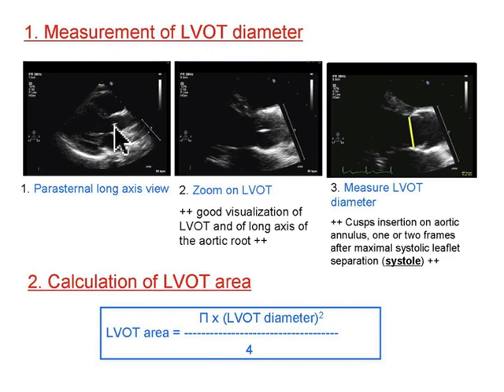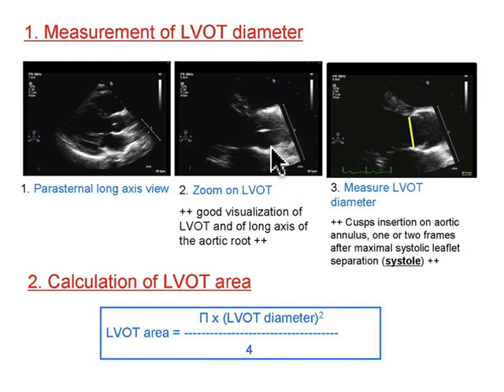Right now I can tell that this aortic valve, when the leaflets come together, they have that little white line at the tip of the arrow — you can see that little white line. That's the leaflets that came together. That's during diastole: the heart's filling and those leaflets are together. This is just a frozen and zoomed-in version of that exact same valve — the leaflets are together.